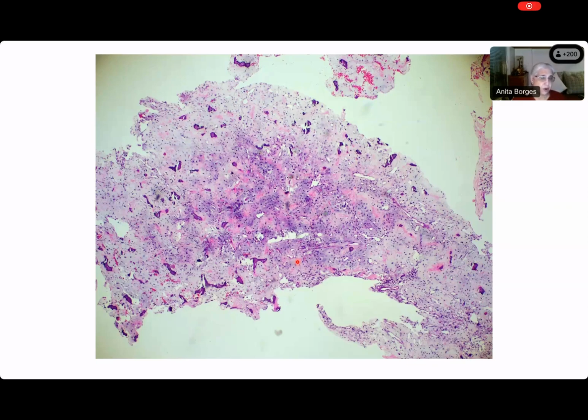I'll give you a hint. It's often round and it's a space. And it is not stroma. Synovial fluid. Yes, okay. But it's not a matrix, no, because it's fluid. Is there any other thing that is in extracellular space?